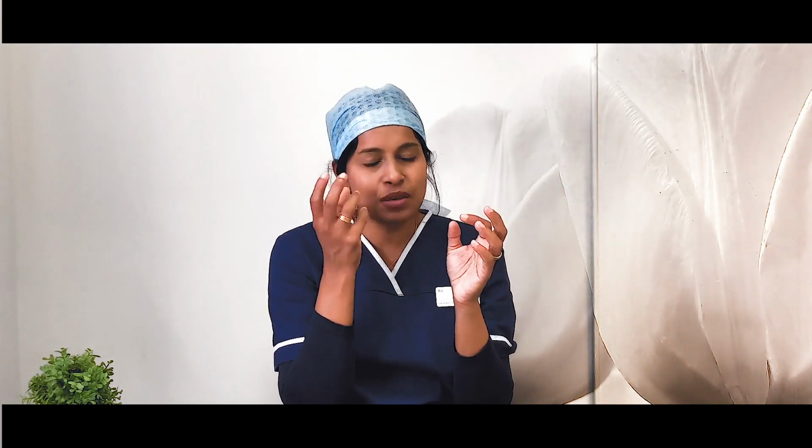So why is that 0.3 important? Anything more than 0.3, obviously the masks have got different layers of protection, and because of the size, it will keep it from penetrating. And anything less than 0.3, they found that there was not sufficient mass for it to penetrate the mask, and that is why the 0.3 is the notorious number that we are trying to keep out. Although the viruses and bacteria, especially COVID, are 0.1. So that is why the notorious 0.3 is important to understand.